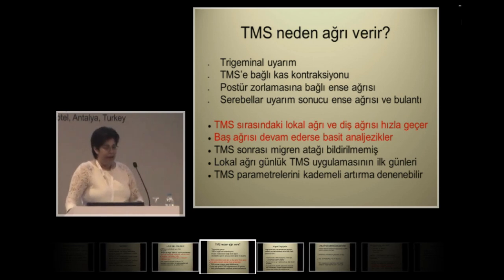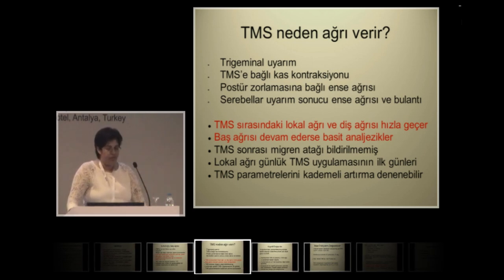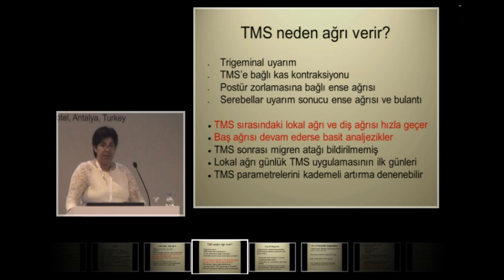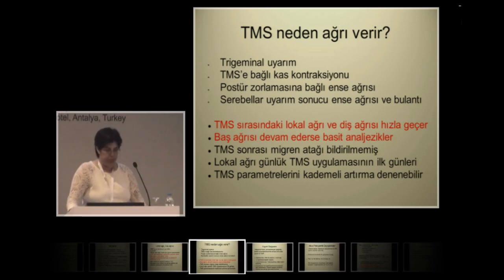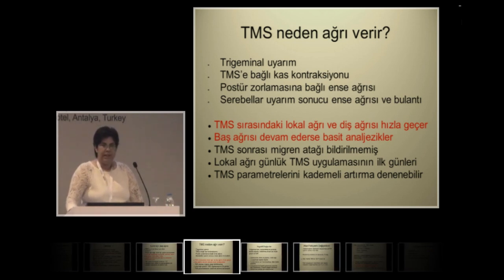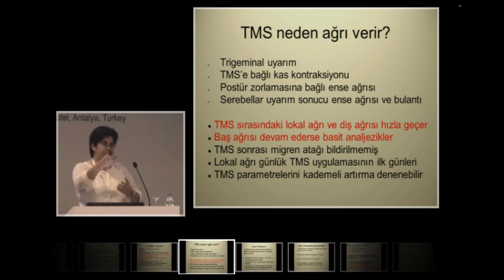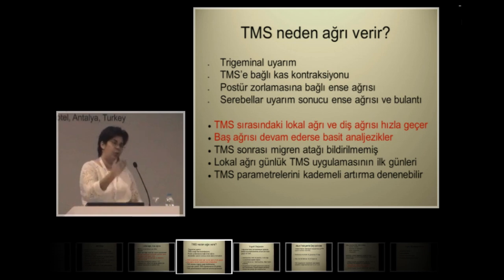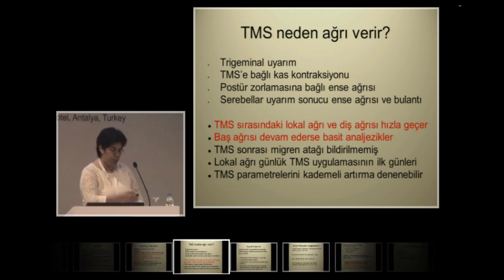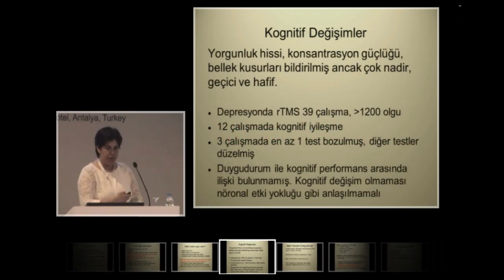This pain disappears when you remove the coil. However, if the headache is persisting, this will be reported by the patient. Mild analgesics will be helpful. As far as I know, there are no patients where a migraine headache was triggered by the TMS. This type of headache usually occurs in the first days of the TMS. And if the patient really complains about these pains, what you need to do is to reduce the frequency.